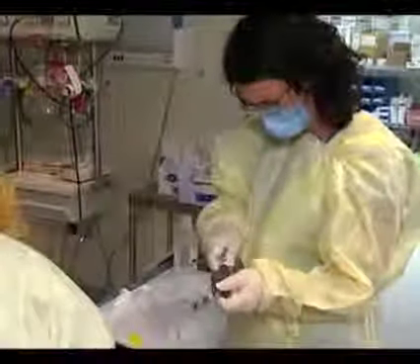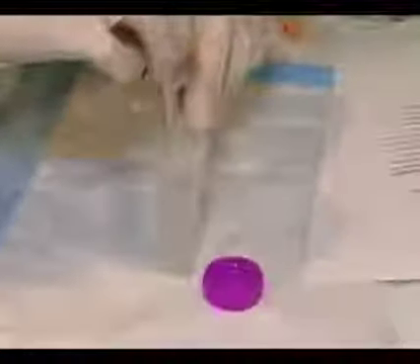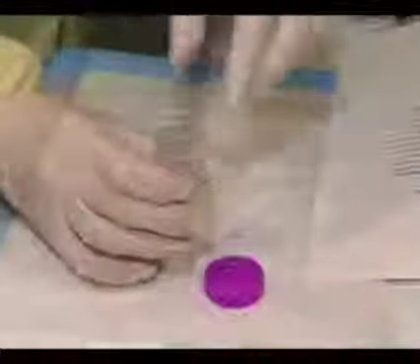And then I'm just going to wait as the slides are being prepared, and I generally like to take 5 to 6 passes to achieve the specimen. And then we'll attempt 4 other sample sites, generally in the same vicinity, all looking for the subcarinal target.